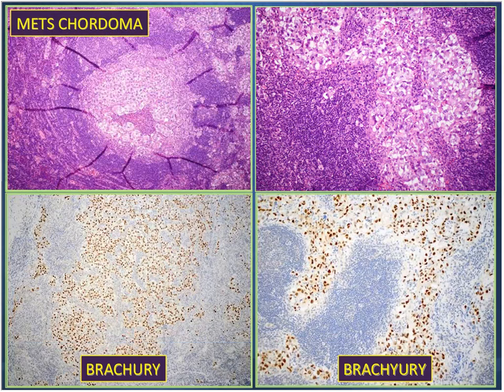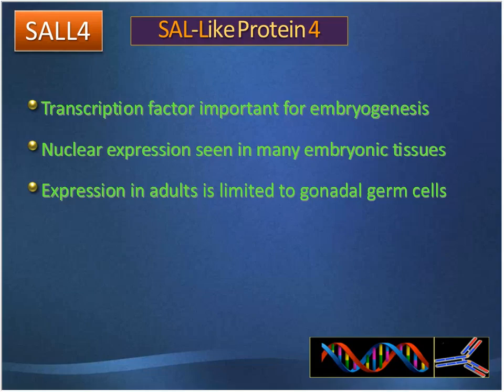However, the staining, with knowledge of clinical history, proved that yes, these tumor cells are positive for brachyury and they are metastatic chordomas. The interesting thing is that the original description of brachyury said it is negative in dedifferentiated chordomas, but we have had at least 2 examples of dedifferentiated chordomas which proved to be positive for brachyury. So again, it is an extremely useful marker for that differential diagnosis when it arises.